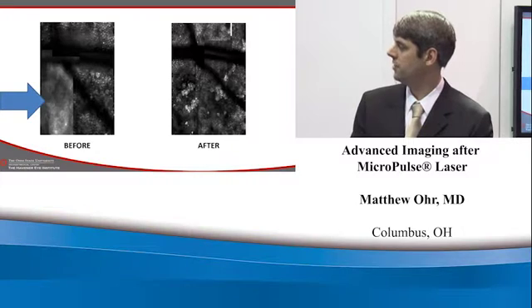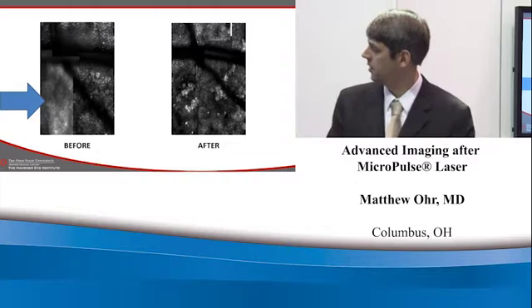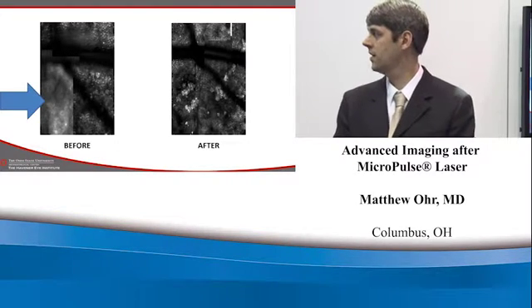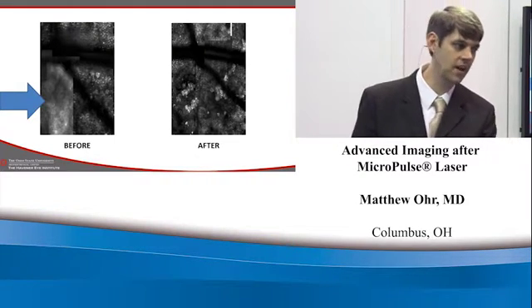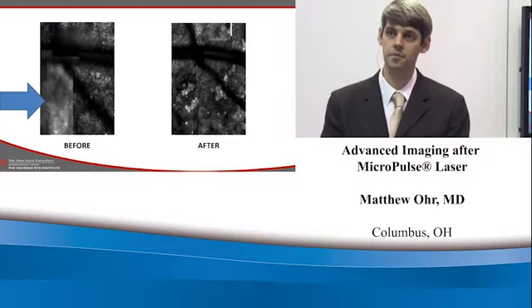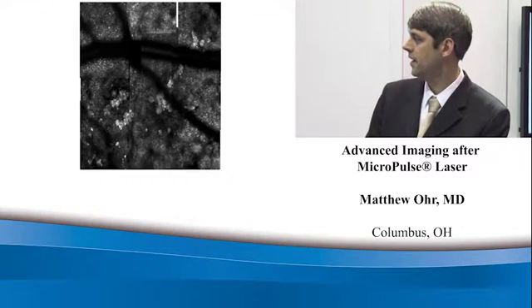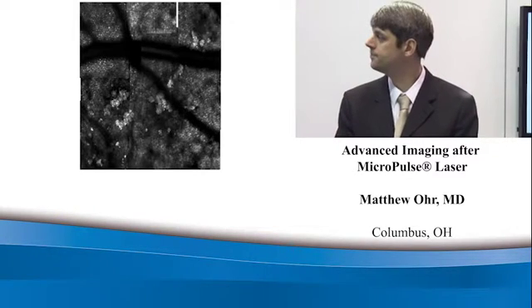And after treatment, what you'll see is the mosaic improves quite a bit. It's not quite projecting as well on the screen, but the individual photoreceptors are a lot clearer to see. And the impact of the laser, which was the most important finding from our side, is that there was no loss of photoreceptors. There was no change to the mosaic or decrease in the rods and cones in that area. In fact, they became clearer and much easier to visualize after the edema had resolved, which we thought was interesting and hadn't been described before. And again, this is just a larger version of that same image.